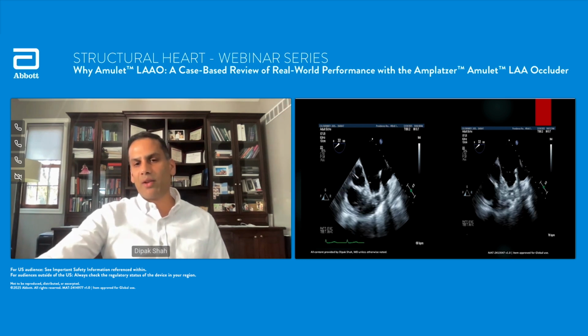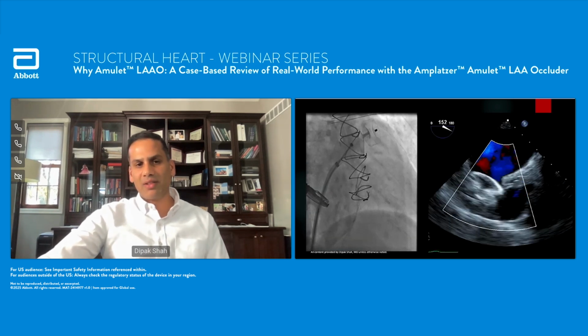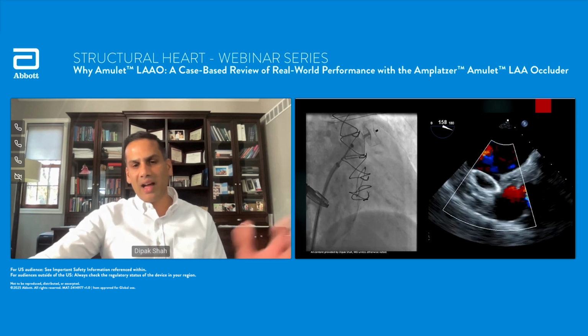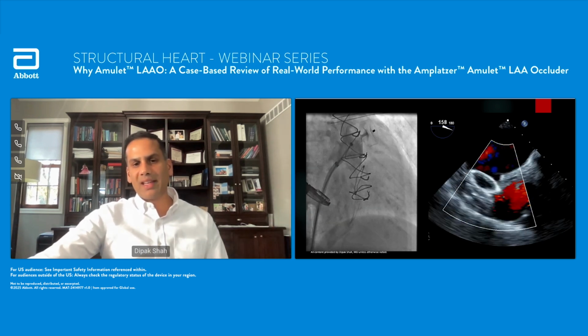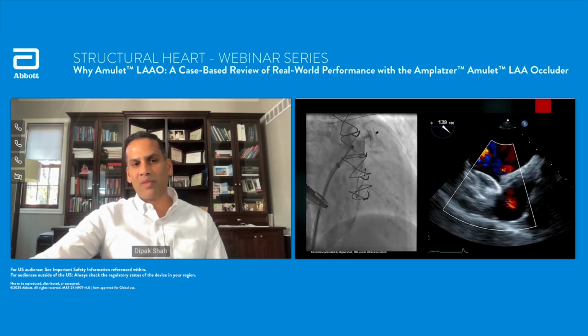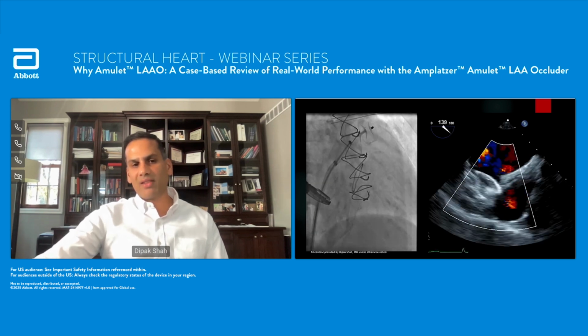And then on the panel on the right, we've deployed the lobe. So we deployed the lobe past the neck. And then on the next image here, you can see that we've got the disc on the other side of the neck here, that there is no leak anymore, and it's completely sealed off when we have it tethered here. And then when we release the device here, again, we've got this sealed off nicely.